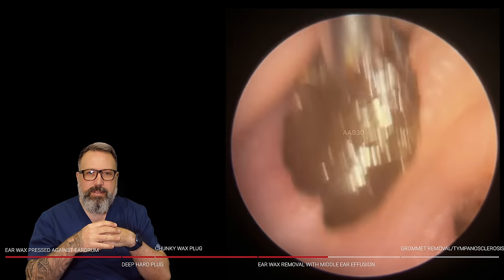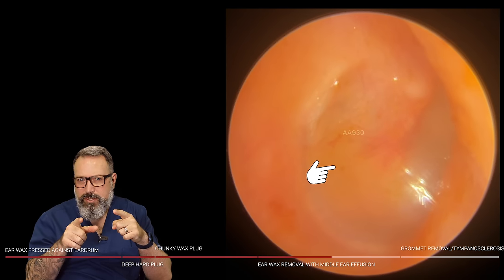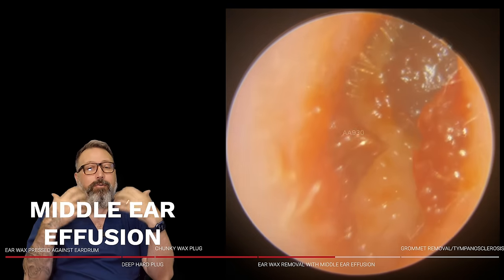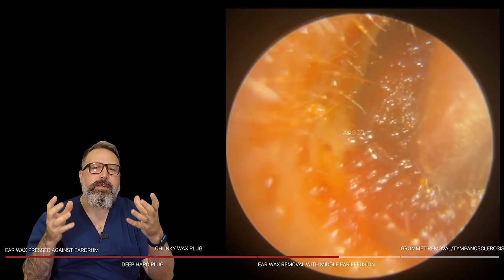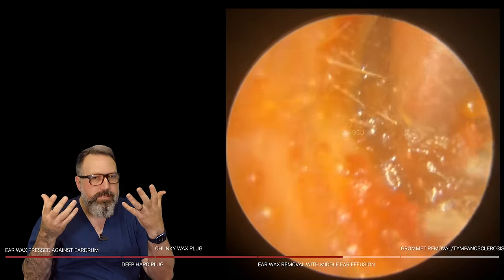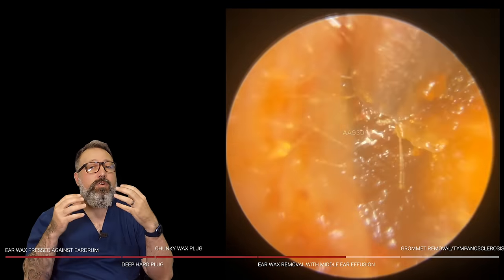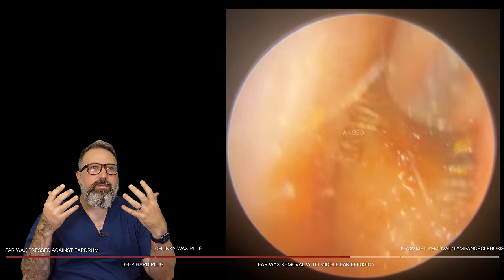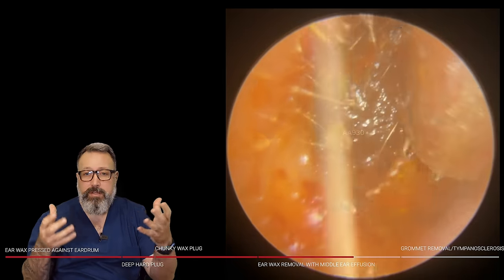Lovely plug. Let's take a look beyond it — there's a couple of straggly pieces to tidy up. Now we talked about middle ear effusion. See that yellow patch on the eardrum — that is middle ear effusion. If you've ever had a heavy cold or any sinus issue, you're more likely to get fluid build up behind the eardrum. The last layer of the middle ear space is surrounded by a mucosal layer, constantly producing mucus that drains through the Eustachian tube. If you're really congested, you produce a lot more mucus and it overwhelms the drainage system, causing fluid build-up — that's middle ear effusion.